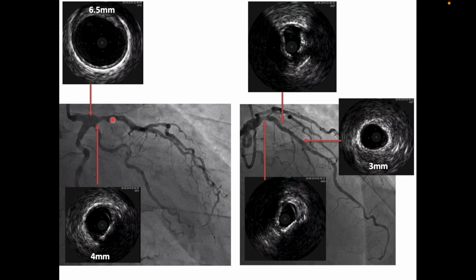But what was surprising for me was that this disease that I see over here has almost 270 degrees calcification, but this region here, which doesn't look that bad, also has a similar calcification with a very small MLA, and this is also significant disease, and the landing zone actually is over here. This is the normal distal reference segment to size the vessel and place the stent. So our target then became to stent from this point all the way and go up till this point here.